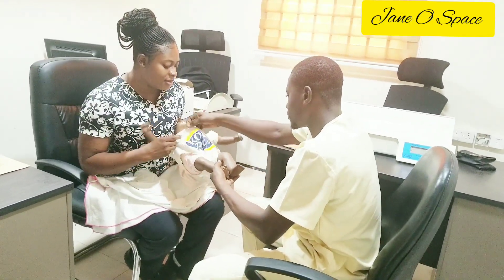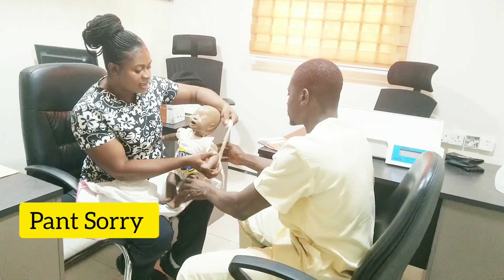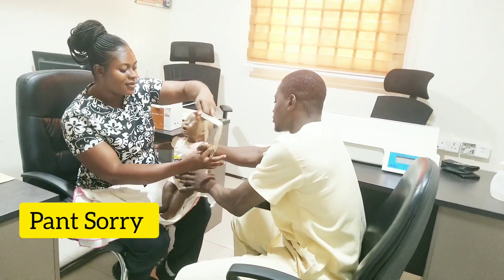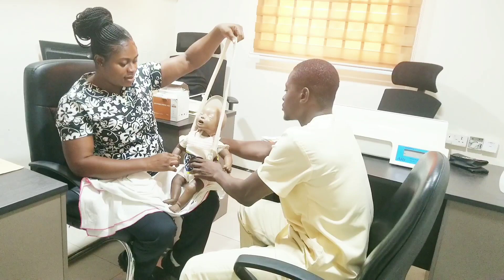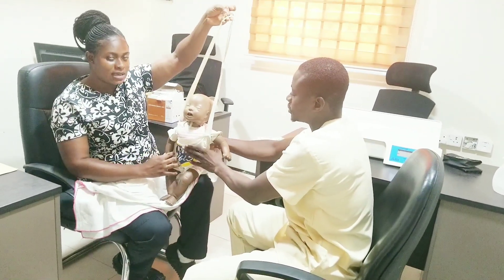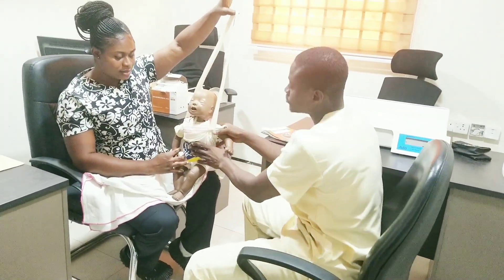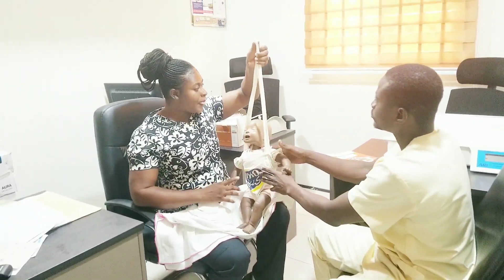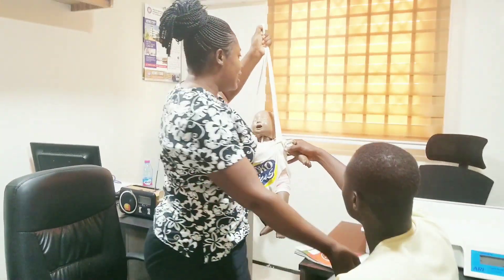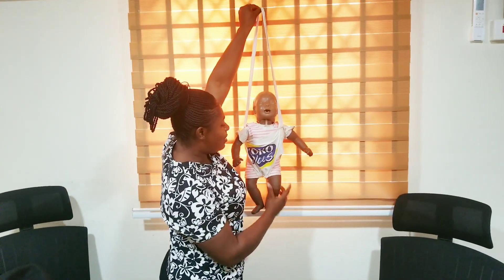After putting on the weighing pants like this, one strap has to go back and one comes to the front — it will be like this. The baby will sit in the pants like this. You have to hold and support the baby, and then we hang the baby on the scale.